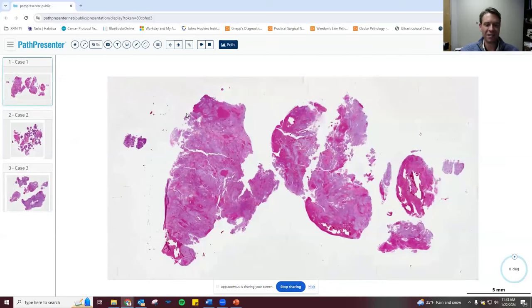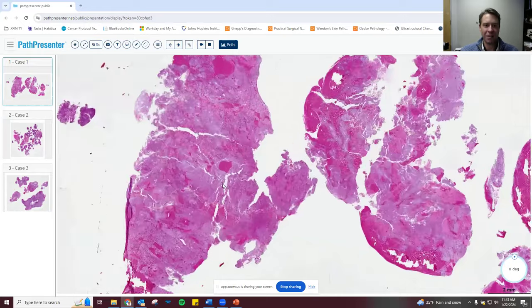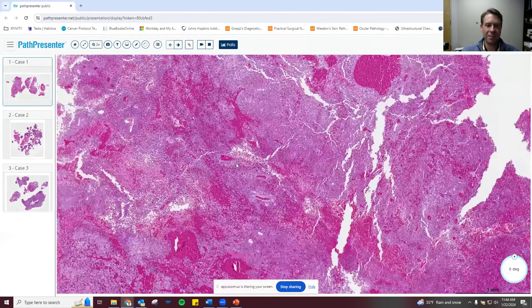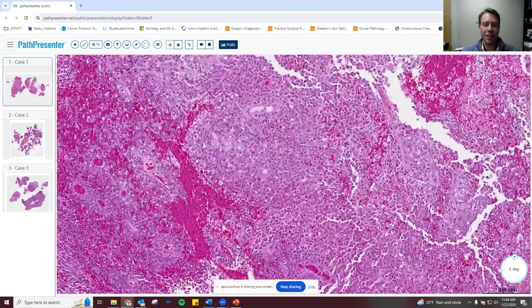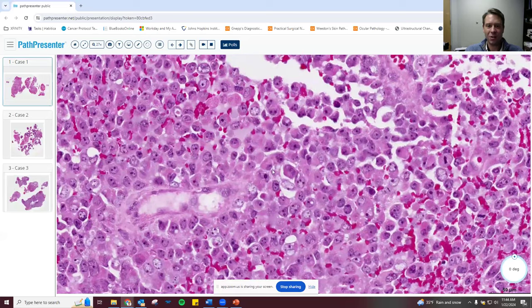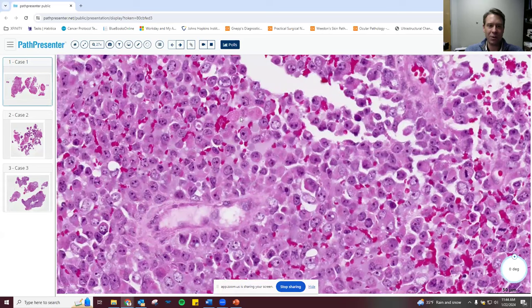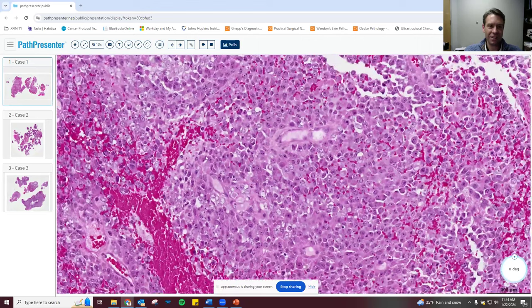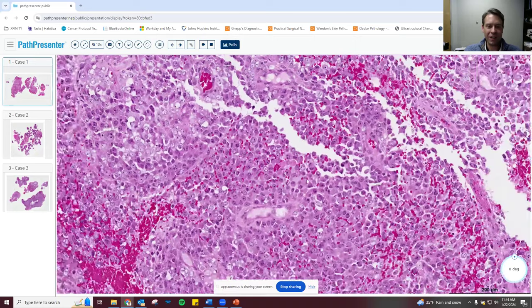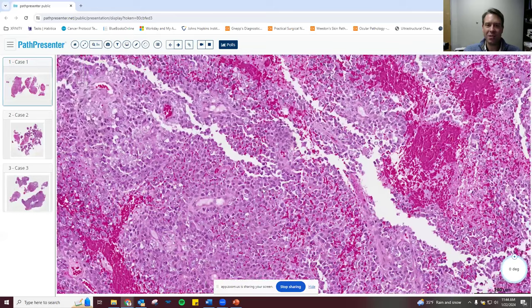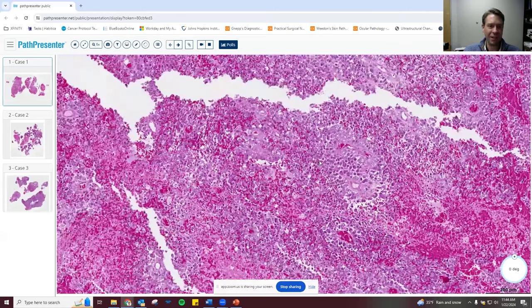Case one: a 40-year-old woman with a 2-centimeter skull base mass that looks bad by imaging. From low power there's a lot of blood, which might suggest angiosarcoma. Looking closer, we notice this is a monotonously malignant look — the cells are all similar in size, cut from the same cloth — with eccentric nuclei placement, plasmacytoid to rhabdoid appearance, prominent nucleoli, and vesicular nuclei. This is an example of a SMARCB1-deficient sinonasal carcinoma, a SWI-SNF carcinoma. The clue is that monotonously malignant appearance; they can be pink or basaloid and blue. Doing INI1 is very helpful. These have a terrible prognosis — about 50% of patients die within two years and they tend to present with advanced disease.